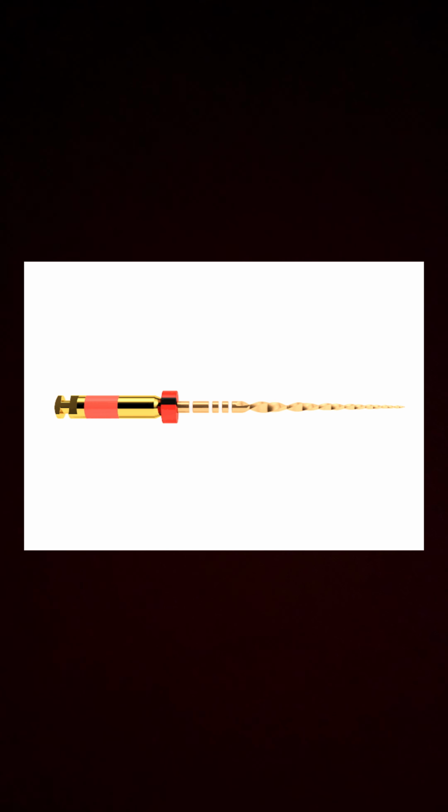What is canal adaptive endodontic instrumentation? It works on a principle. In low stress, the file rotates in continuous motion. In high stress, it switches to reciprocating motion. This adaptive motion reduces instrument fatigue and fracture.